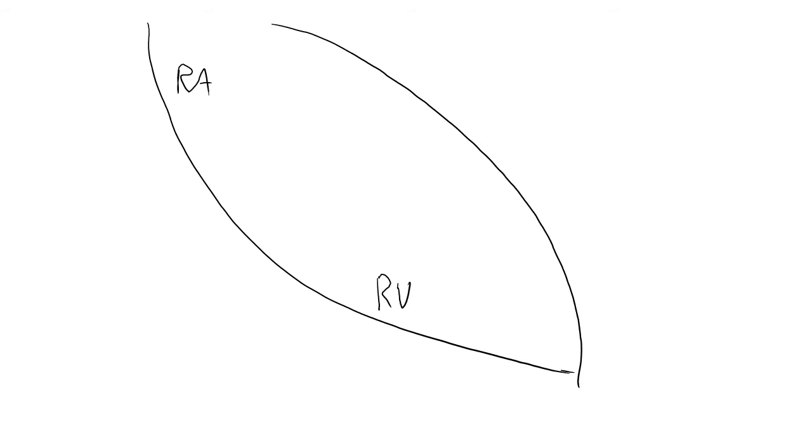Now, if I draw a heart here, so once again we have the right atrium, right ventricle, left atrium, and left ventricle here, we can essentially identify where an ST elevation has occurred based on which leads have an ST elevation. Now, this isn't always correct because, as you all know, coronary arteries, coronary veins always have a little bit of variation between them, but we can pretty much, quite accurately actually, measure where an ST elevation is occurring in terms of where it is on the physical heart.